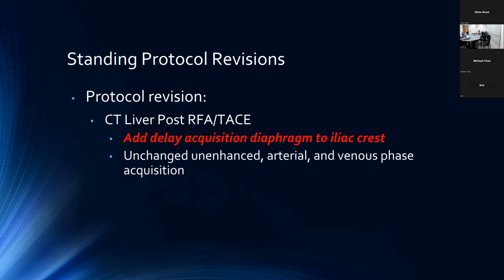primarily because these are mostly done in cases of HCC, and that delayed phase imaging quite substantially increases our sensitivity for looking for washout of recurrent lesions, and is quite useful in improving our accuracy. So that's the main reason for including this additional delayed phase.